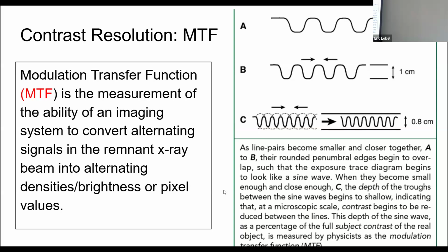So if the object is 0.9 millimeters, just short of 1 millimeter, and your focal spot is 1.2, and your pixel is 1, can you see the object? No, right? Because it's smaller than both of them. Let's say it's 1.1. Can you see it? No, because it might be bigger than the pixel, but the focal spot being at 1.2, still no good.